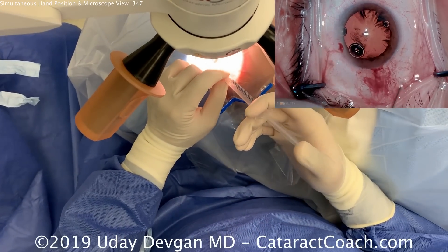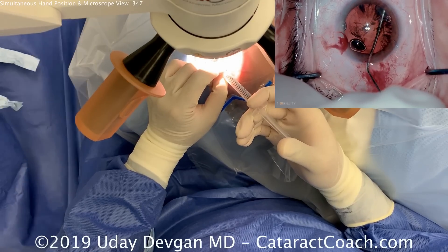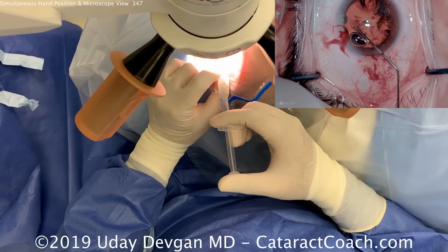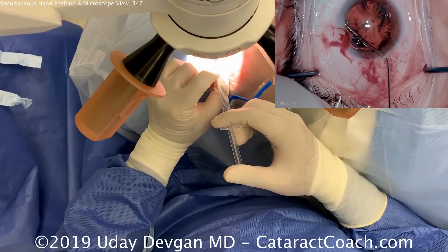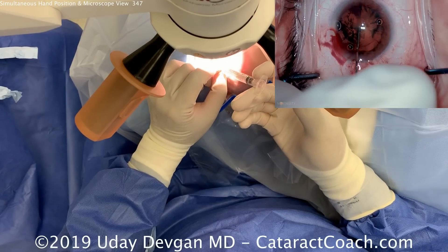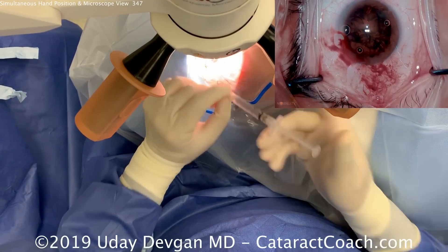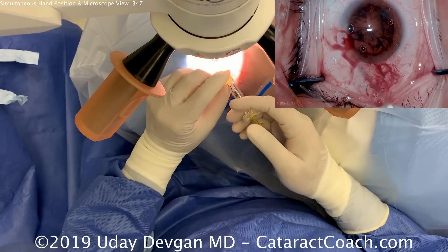Now time for balanced salt solution for the hydrodissection. The left hand is holding the cannula tip to make sure it doesn't fly off inadvertently — these are held on by friction. If they get clogged and you push on the plunger very forcefully, you could actually shoot it out like a missile and damage the eye.